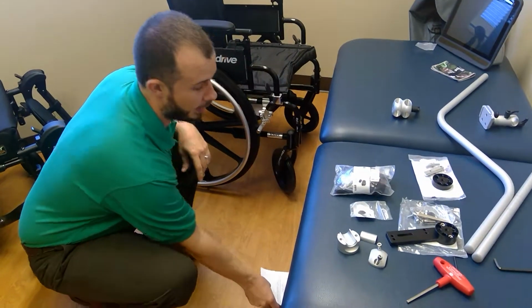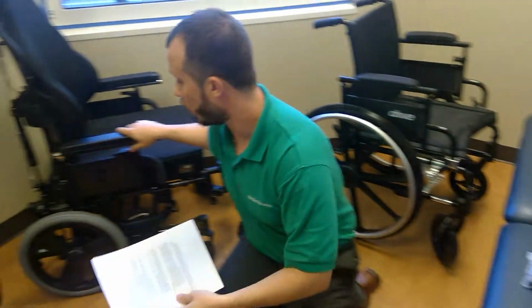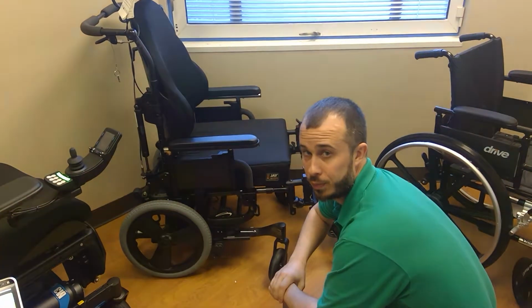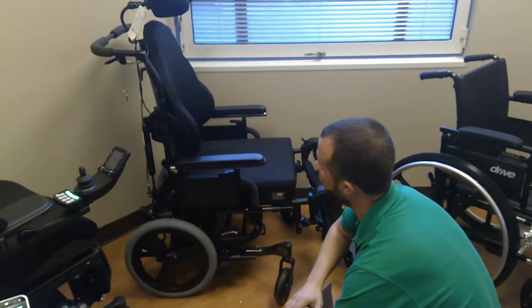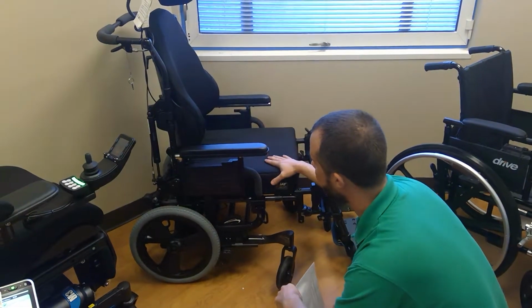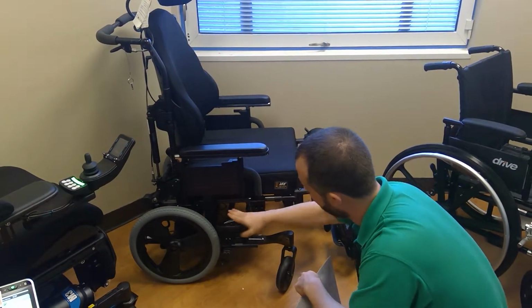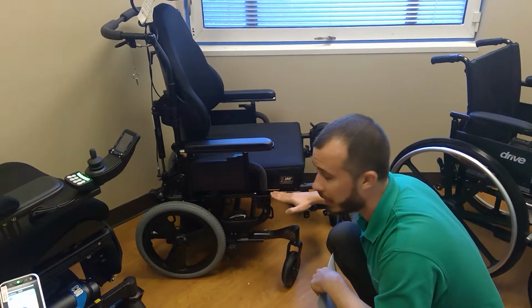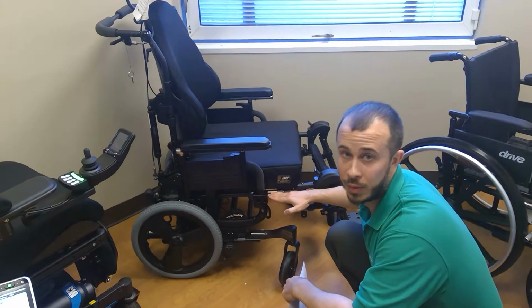Now, if we were looking at a second manual wheelchair, maybe one that does tilt, we do all the same things, right? We're looking for obstructions. We're looking for where does the device have to be once it's all said and done. But on a chair like this that tilts, we want to try and find somewhere on this tube that allows us to mount, because this is the tube that's going to lift and lower as they tilt the chair itself.